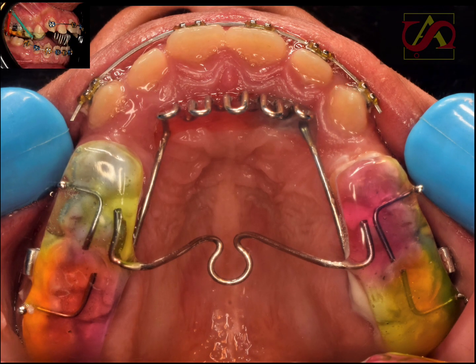This is the design of the appliance. The design of the appliance has a tongue guard, which is present in the rugae area, and it also has a TPA in the roof of the mouth, and this is the acrylic cap which covers the posterior teeth and has two arms to apply the forces on it.